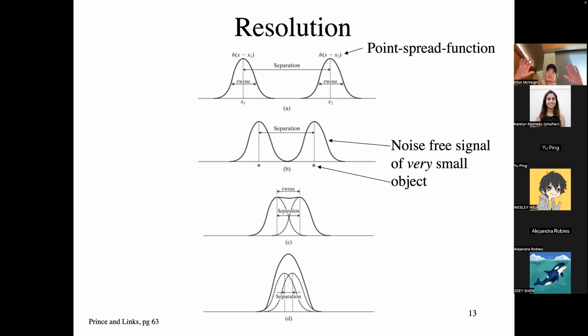I can reconstruct the image such that I see the shape of the picture of that tiny dot, okay? And in CT, what we do is we take really good Japanese pens and we break the top of the pen and take the ballpoint out of the top of the pen. It's like 0.2 millimeters in diameter or something. It's usually made of tungsten. Then you can put it in the scanner and it's a tiny dot in the scanner. Another way of doing it is if you have a really thin wire, like 500 micron diameter wire, and you put the wire in the scanner.